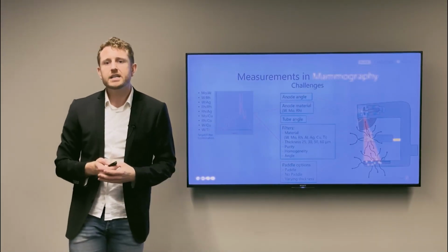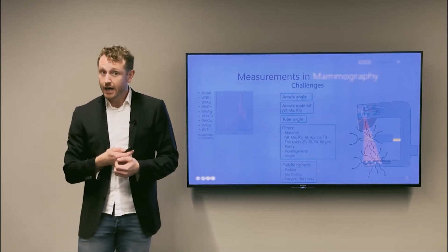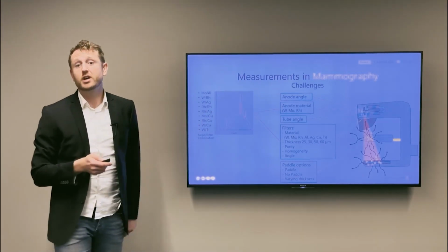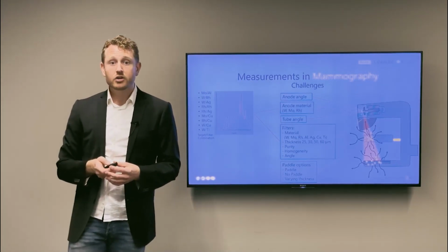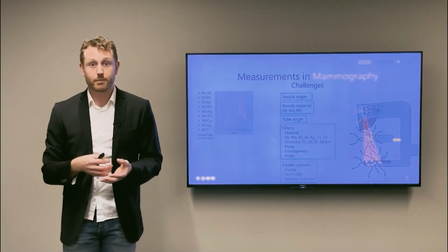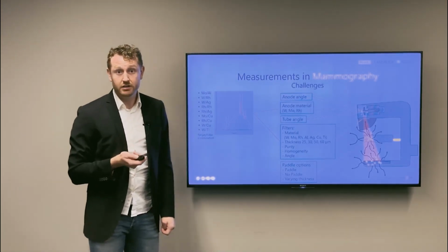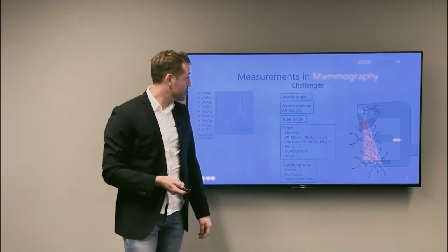And these peaks and drops are material characteristics. By combining different materials, one can use these peaks and drops to construct an optimal spectrum for different types of breasts. Not only does a mammography machine have a much more complex photon spectrum compared to regular radiography, the small geometry and big variations in anode angles and materials between each machine makes it even harder to do proper measurements.